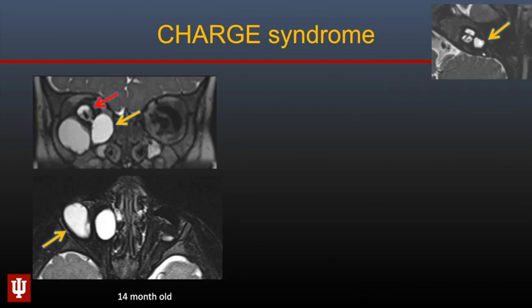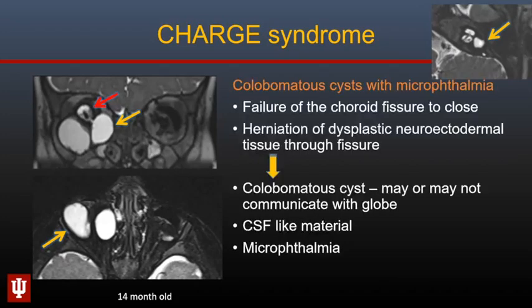Here is a 14-month-old with CHARGE syndrome who has a small dysplastic microphthalmic globe but also large cysts within the orbit — these are colobomas occurring in the presence of microphthalmia. They occur because of failure of the choroidal fissure to close, with herniation of dysplastic neuroectodermal tissue through the choroidal fissure. The colobomas may or may not communicate with the globe, and the globes are typically microphthalmic.